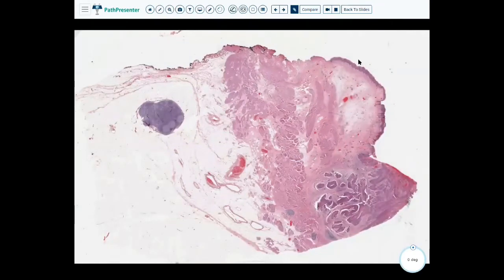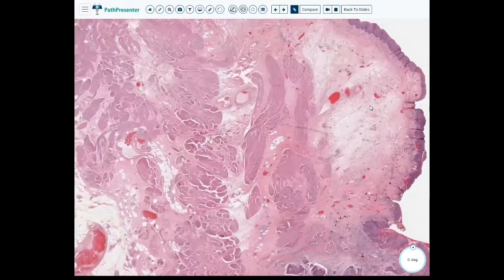Case 3, so we definitely have some urothelium here. Looks like maybe there's potential for ulceration here with all the blood. And this looks kind of funny here too. This is a lymph node, and I can tell that even at this power. So, okay, they took out this bladder because we can see full thickness, right? So our muscularis propria, and you can see the 2 layers of the muscle, and then we have our fat here. So even though you can have fat in all layers of your bladder, seeing this is a full cross section.